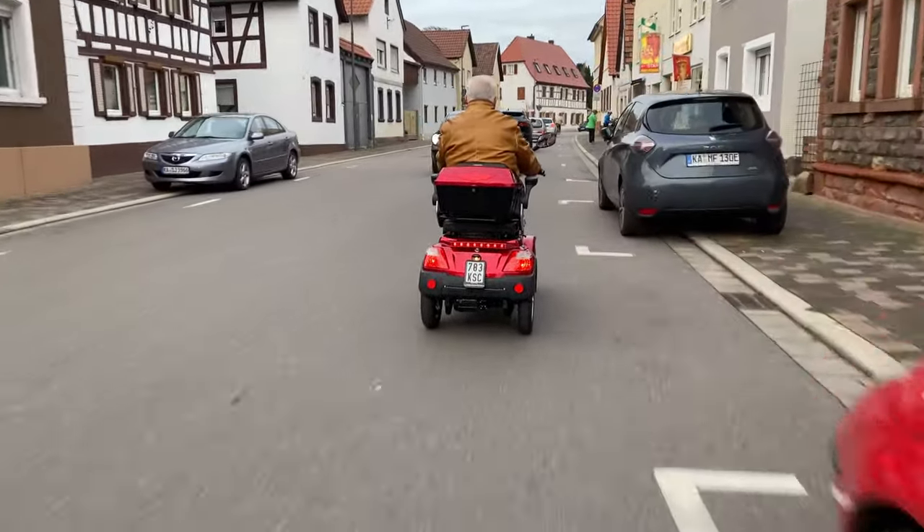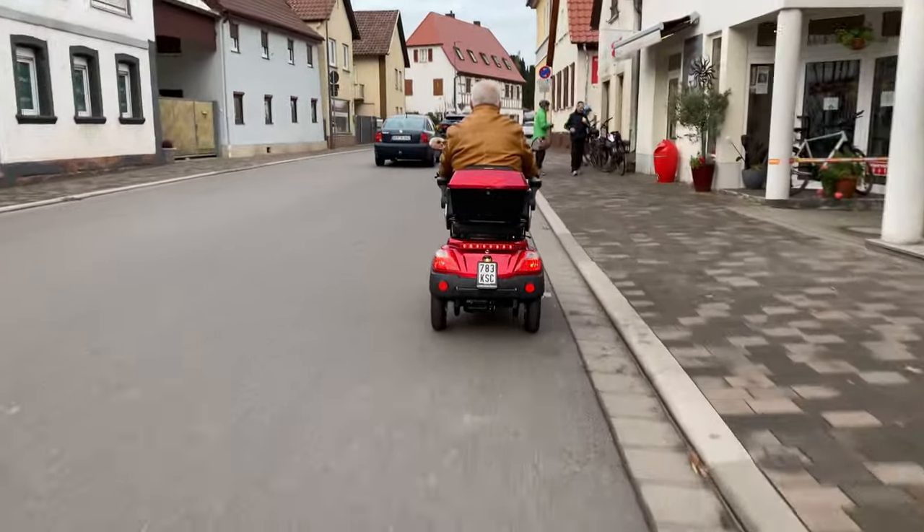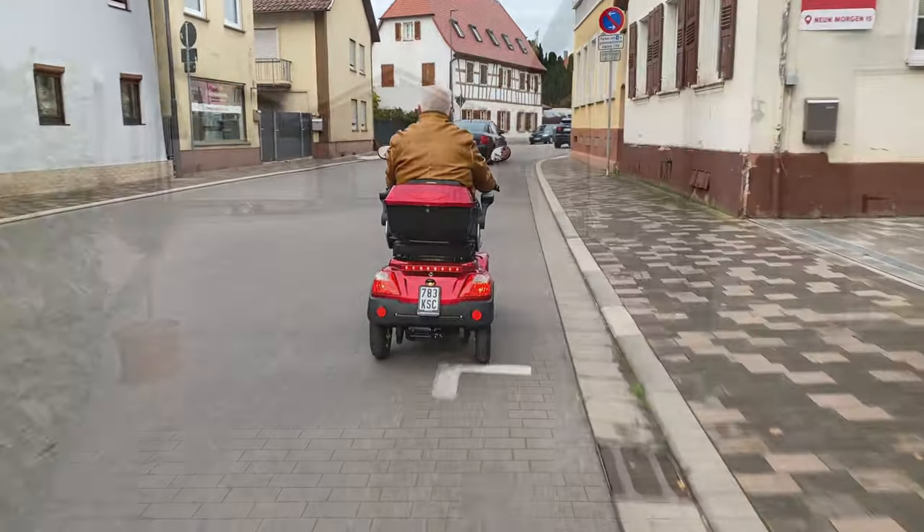The minimum age is 15 years. Mobility scooters for people born before April 1st, 1965, can be driven at up to a maximum of 25 kilometers per hour with an existing license.